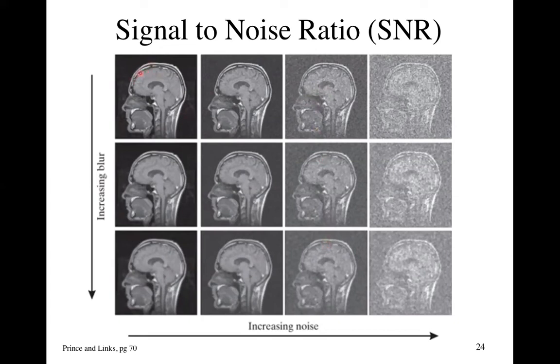And here you can see the very fine features of the cortex, etc. As we blur or convolve, we lose those fine features down here. Let's say these fine features at the bottom of the tongue all get blurred here. So depending on where you want to operate in terms of spatial resolution and signal to noise, you choose your appropriate blurring filter, or another way of saying it is your appropriate MTF, because you can essentially filter your image after taking it to achieve an MTF.